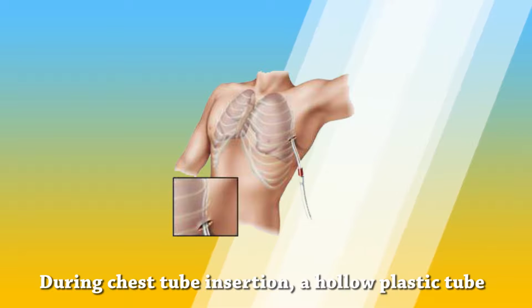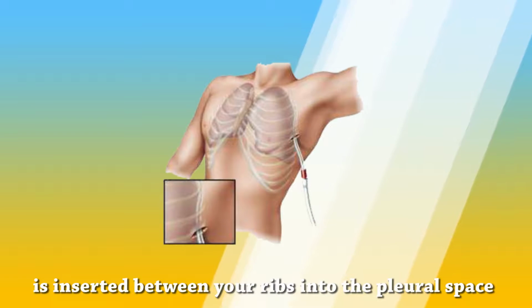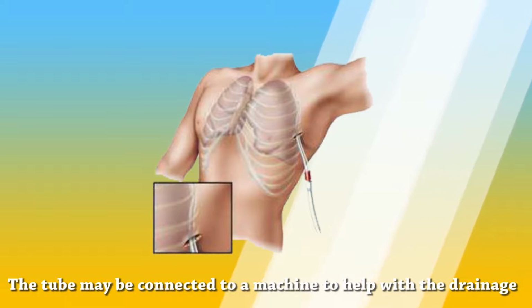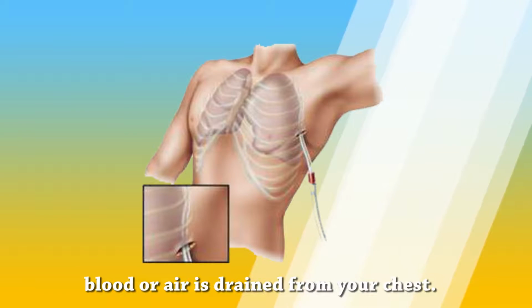During chest tube insertion, a hollow plastic tube is inserted between your ribs into the pleural space. The tube may be connected to a machine to help with the drainage. The tube will stay in place until the fluid, blood, or air is drained from your chest.